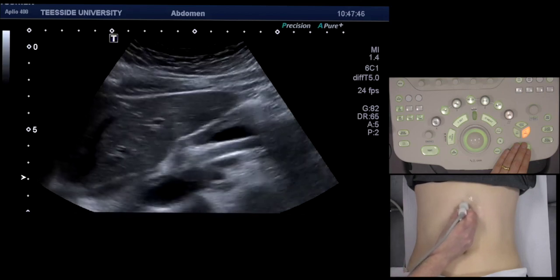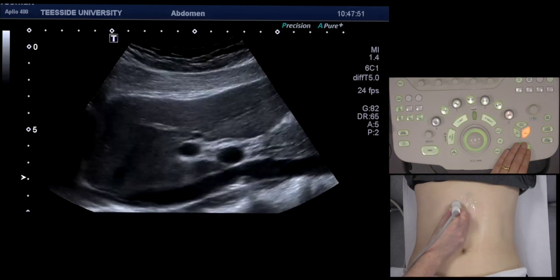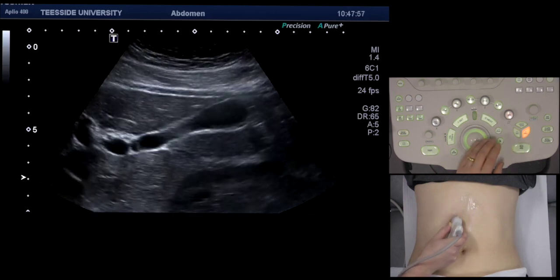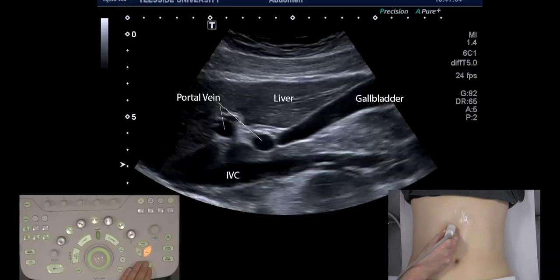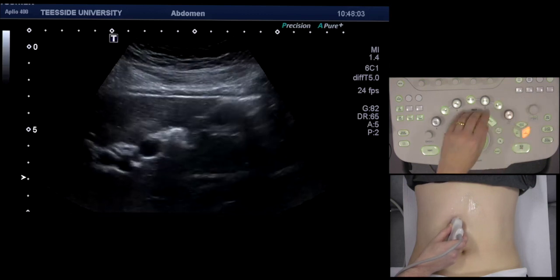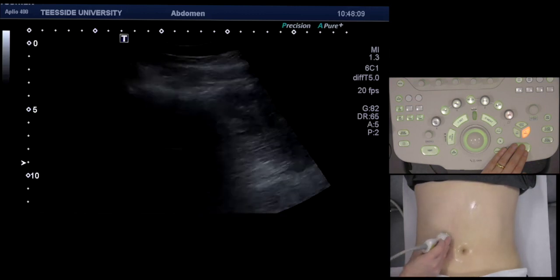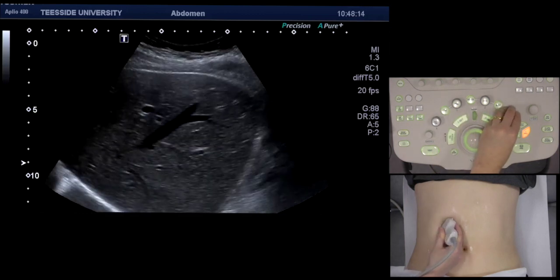I always start scanning the gallbladder in the midline like this and then move laterally until I can see the gallbladder. As you can see, I've just swept across and I'm getting a nice view of the gallbladder. You don't always see this due to bowel gas — this is just an image of the anatomy in more detail. The big problem is the bowel gas, which you have to work around. With some people, this view won't work at all.